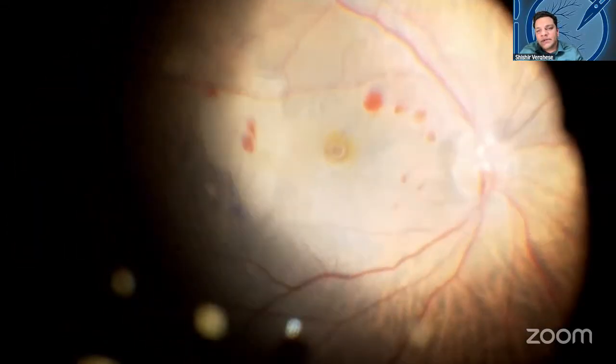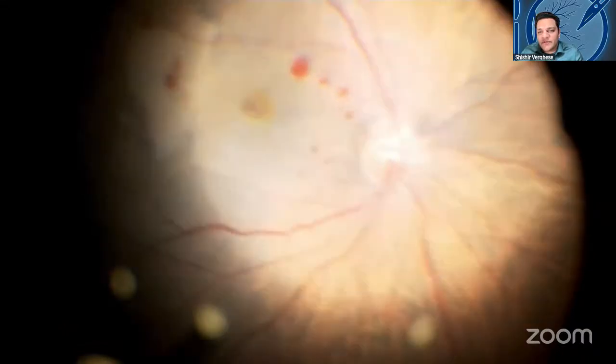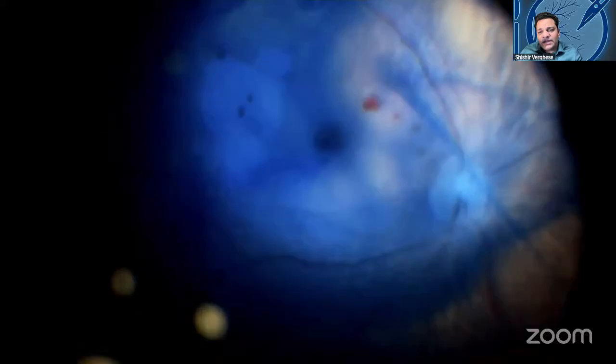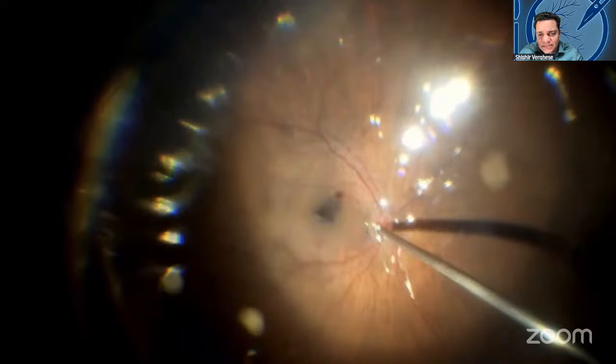So I usually operate at around 25 to 30 millimeters of mercury. And in such a case, I'll ask her to raise the IOP to around 40 to 50 millimeters of mercury, which will contain the bleed. Now, since my visualization was reduced because of the poor staining, I restained it. And then you can see how well it's stained. And that's the end of the surgery, where the bleeds tend to form a small clot, and it's contained under the fluid air exchange.